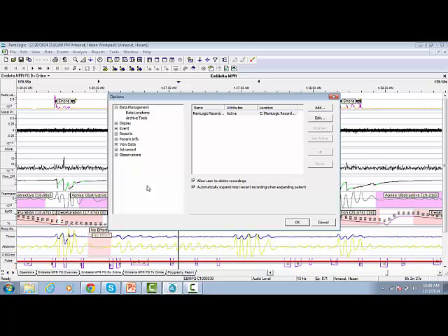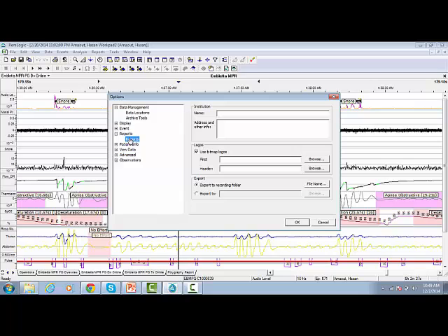Click the Reports tab and type the institution's name, address, and other information. This information displays in the report title section of all active reports.